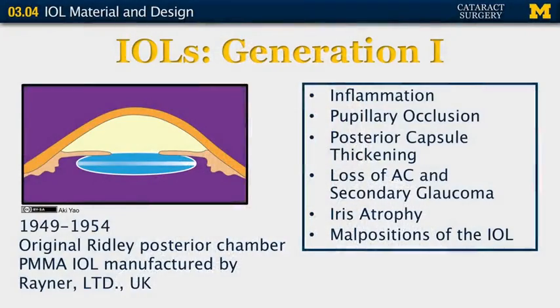I am a comprehensive ophthalmologist at the University of Michigan, Kellogg Eye Center. I am speaking today on intraocular lens material and design. Let me start first with a history of intraocular lenses.